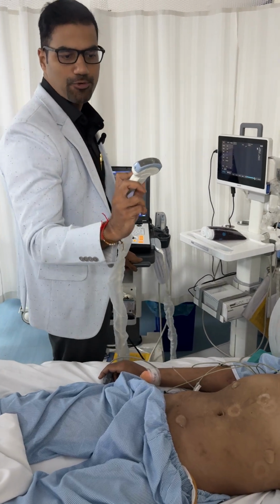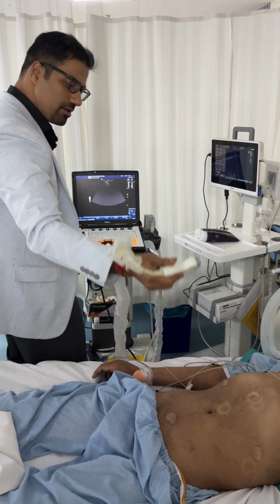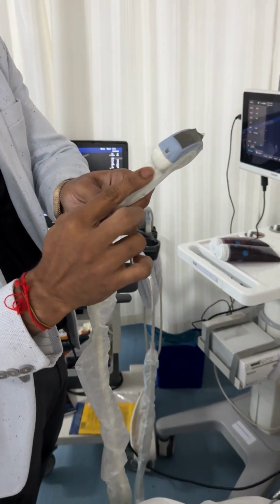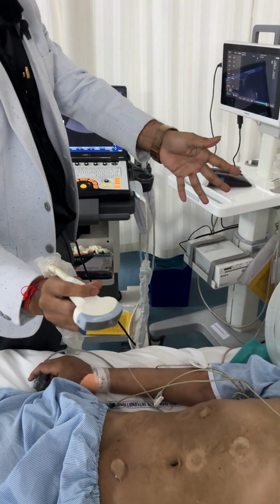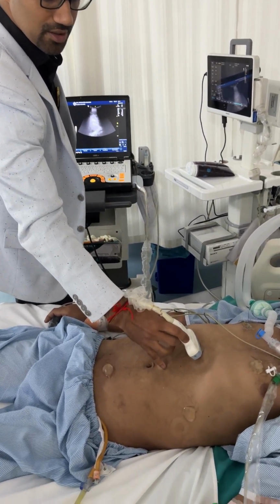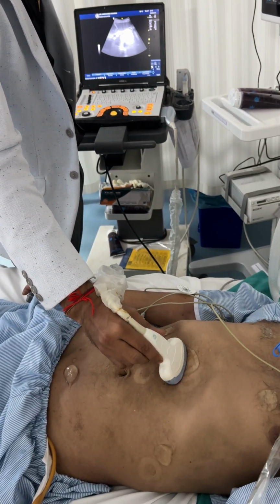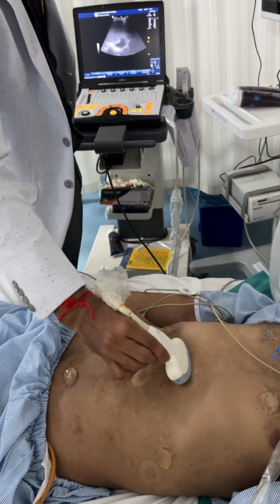So here I'm taking this probe, which is the curvilinear probe or the abdominal probe, and then the orientation. If you see the orientation, this is the marker. The marker has to be towards the right shoulder of the patient, and there are two orientations. One is the transverse orientation, which is this. The other is the sagittal orientation, which is this. Generally we start off with the transverse orientation.